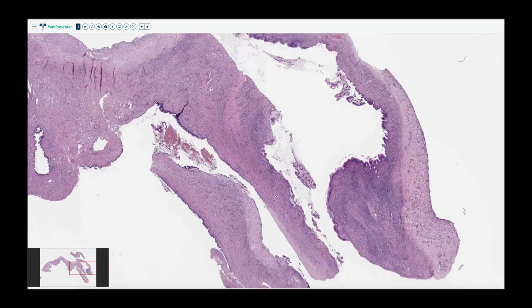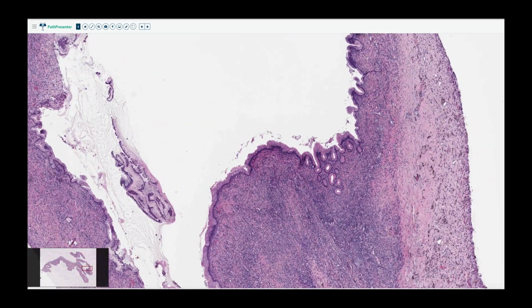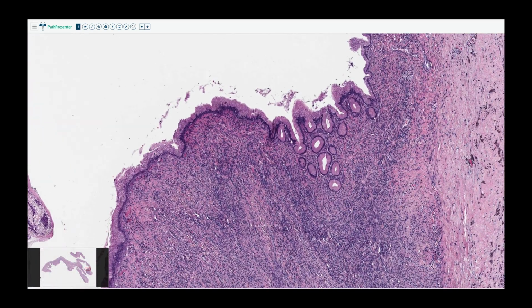There is a little bit of something here that might get confusing for those starting out. So you see here, this is a simple layer, and it almost reminds you of a colon biopsy or something, right? And these are probably actually just tangential sectioning of the tubules, which gave rise to this surface proliferation here. So just to have a borderline tumor, you really want to see more outpouchings and projections. So that's all okay. That's still covered within a mucinous cystadenoma.